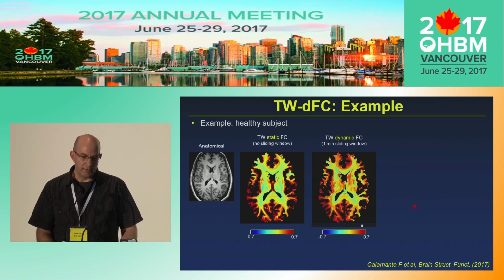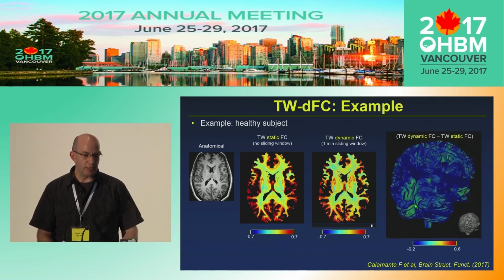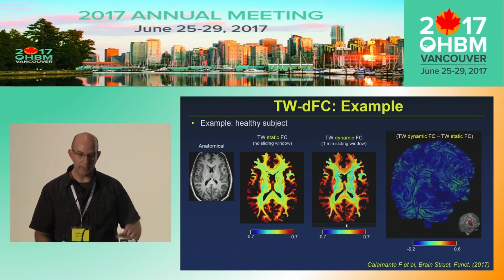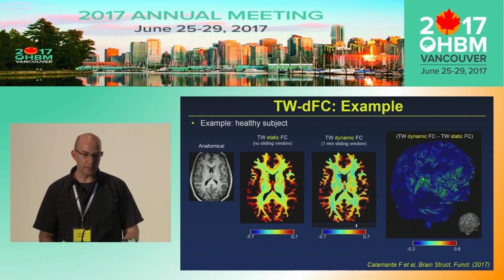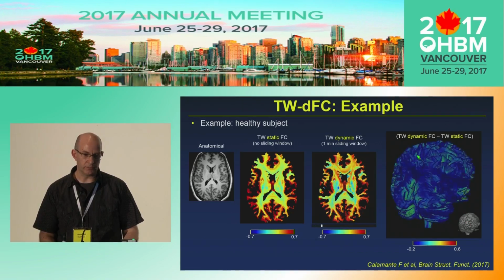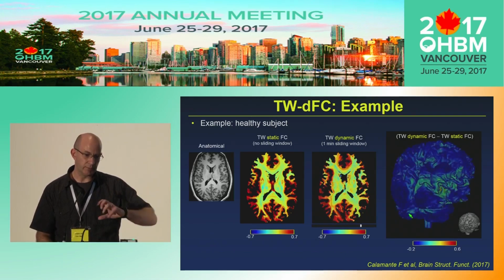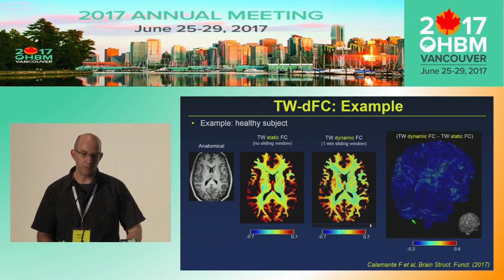Another way we can visualize this is going to the gray matter, white matter surface. And if we look at here, again, we're looking at the changes in synchronization. We're looking at a subject from the back, from up on the back here. And you can see, if you're familiar with networks, the nodes that appear are things in the visual cortex, sensory motor, part of nodes of the default network, temporal areas, cerebellum areas. So these are areas that are becoming synchronous and disappearing during the sliding window approach.